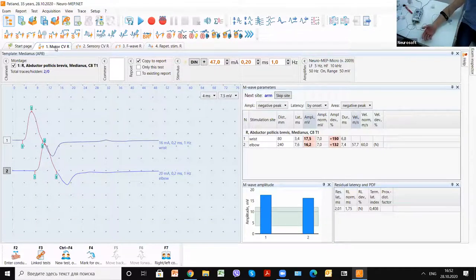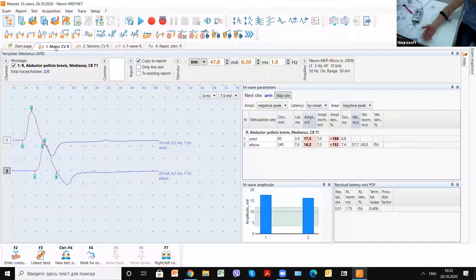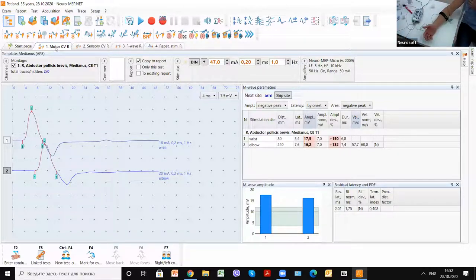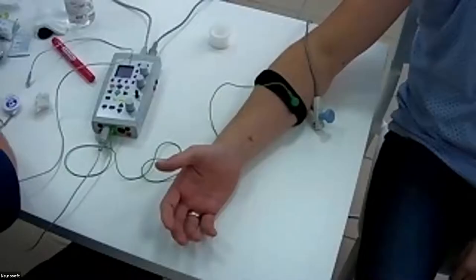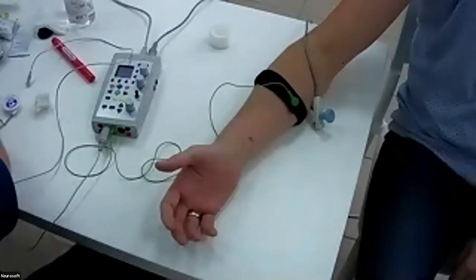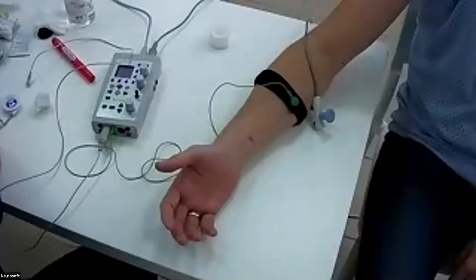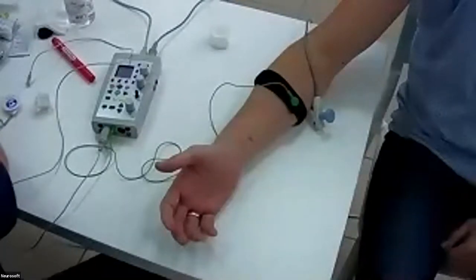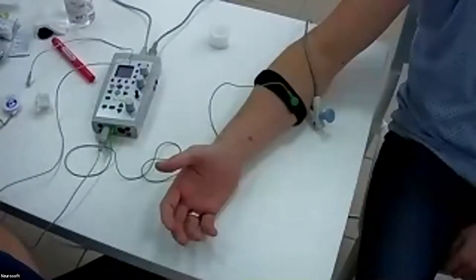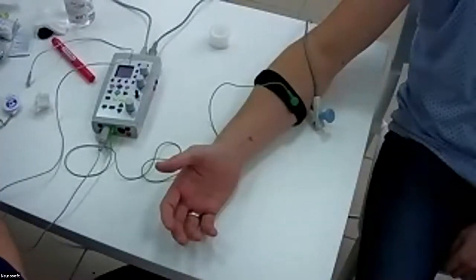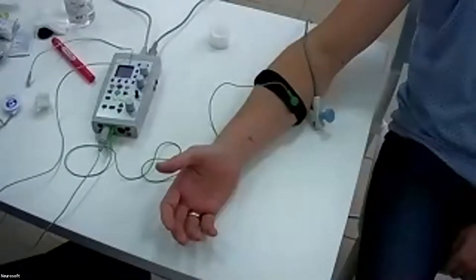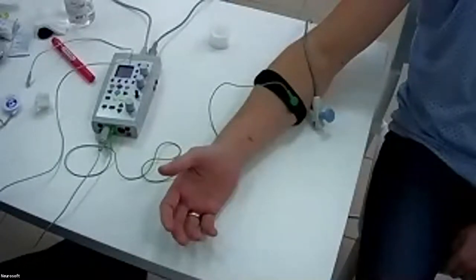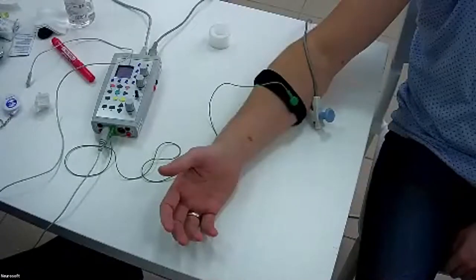After that, we must put on gloves. We put on gloves because it's an invasive procedure.